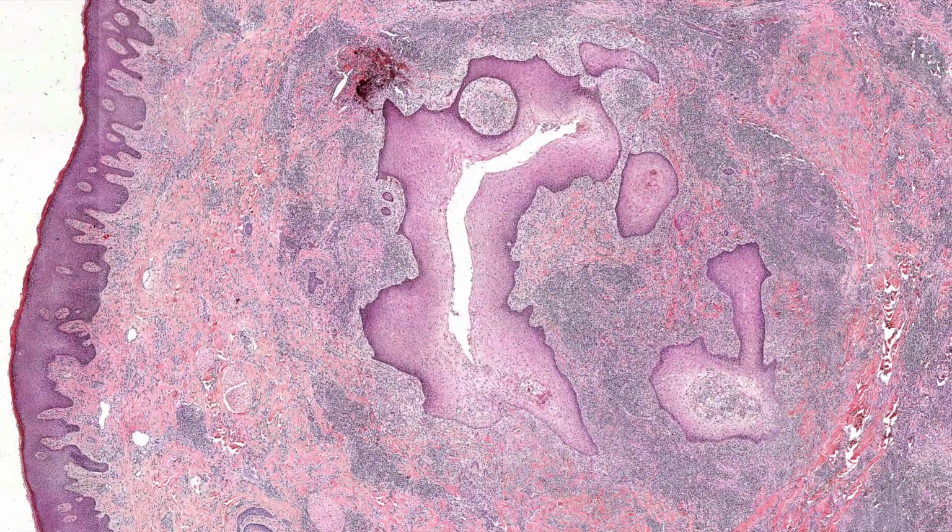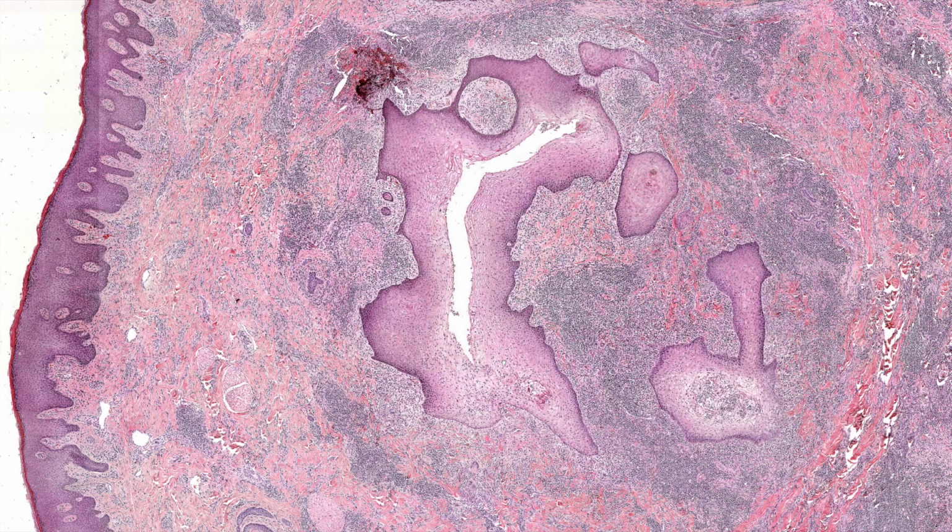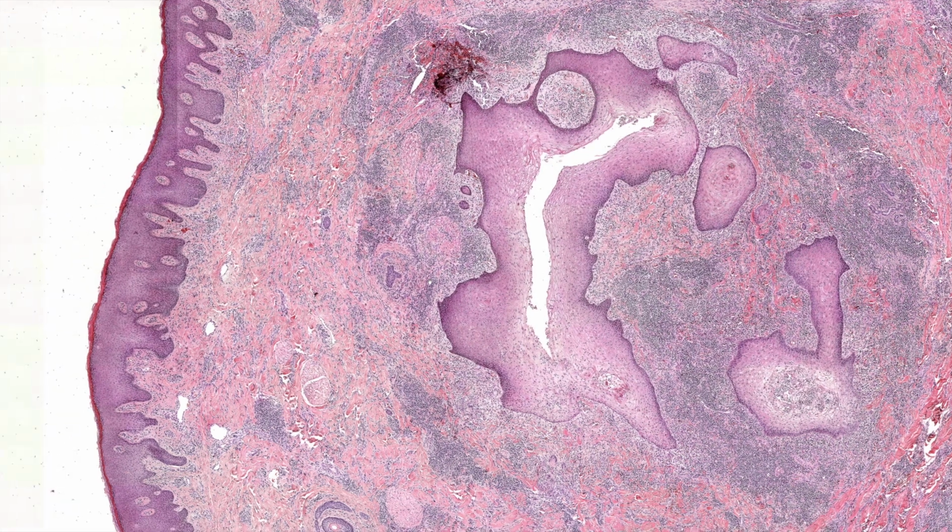What you see microscopically can vary greatly from case to case, and the clinical picture is dramatically important. If you just showed me this and said rule out cyst, I'd say cool, inflamed ruptured cyst, no problem. If you told me you wanted hidradenitis suppurativa, I'd say consistent with hidradenitis suppurativa. If you told me this was a draining tract in the superior gluteal cleft, and you wanted pilonidal sinus or cyst or tract or pilonidal disease, as I call it, I would say consistent with pilonidal disease.